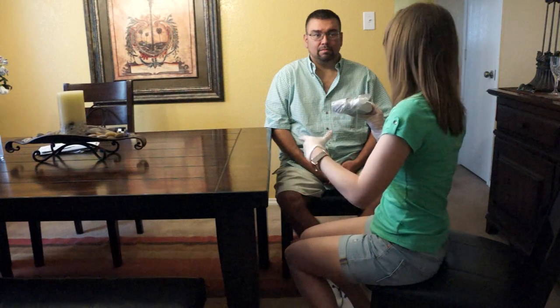Then I'll say keep going, and I'll let you know exactly when to take a big deep breath in, okay? There's going to be a time where you feel like there's no airflow coming out, and I'll say keep going, even though there's no airflow, because the machine actually senses it, even though you feel that way. Okay, do you understand it so far? Yes. Okay.